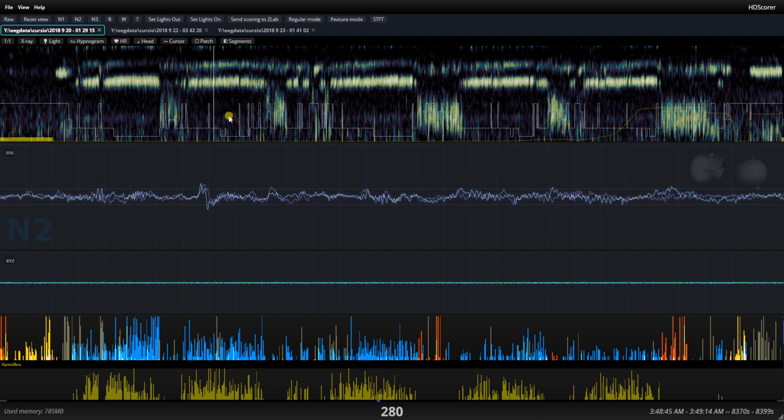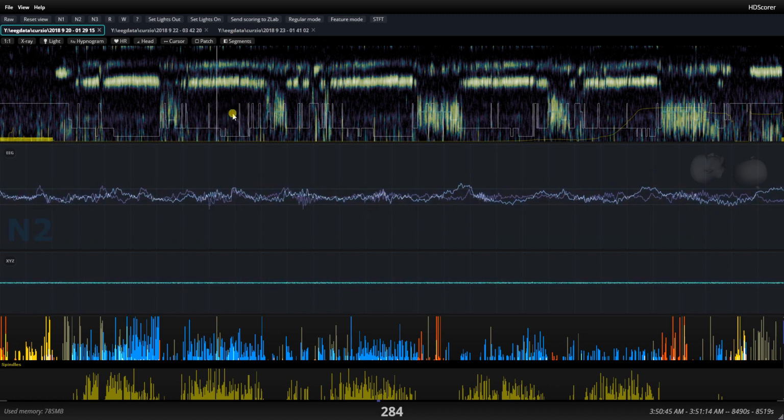If you look throughout similar records for the same participant or across participants, if you do it like this, it's more repeatable whether an epoch gets judged N2 or N3. It depends less on the particular distribution of features within an epoch. Anyway, I think I spent enough time on that.